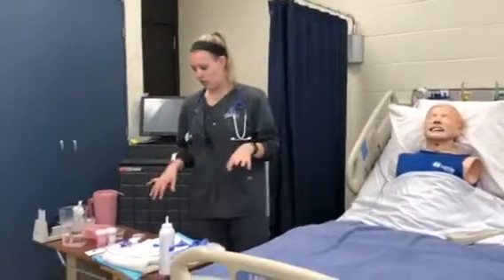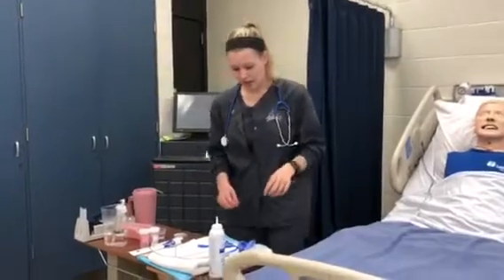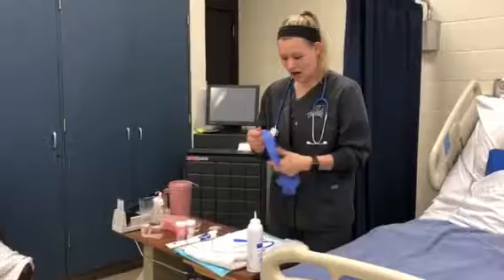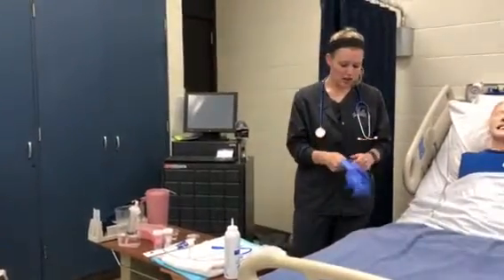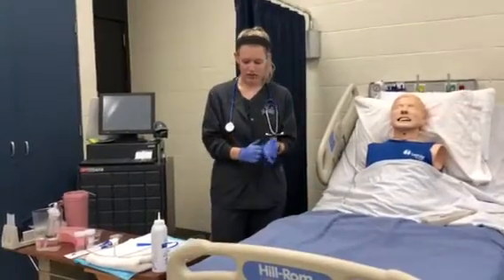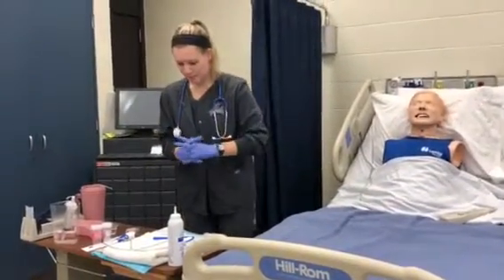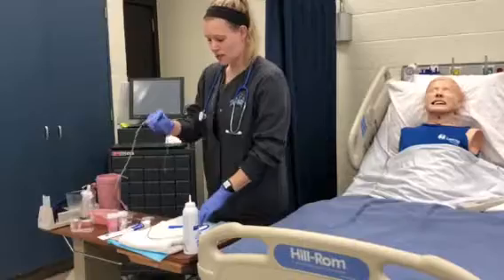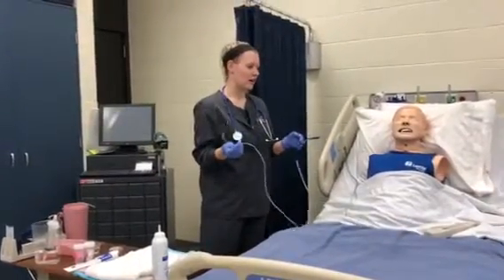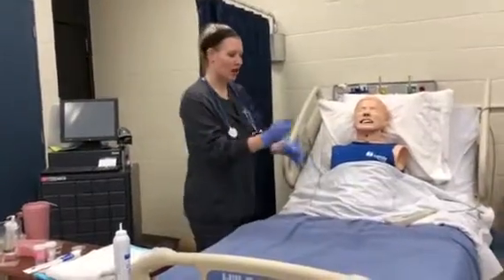So we have all of our equipment gathered here, so I'm going to wash my hands, put on some clean gloves. This is not a sterile procedure because we're going into the intestines, or the stomach, the GI area. So the first thing I want to do is take my tube and measure how far I'm going to go down, because without knowing how far I'm going to go down, I don't know if I'm going to make it in the stomach or not.